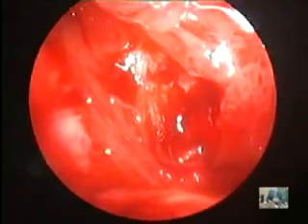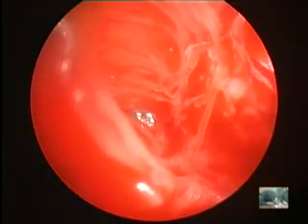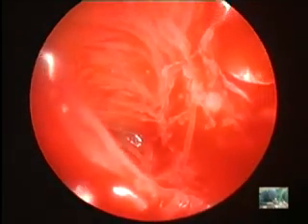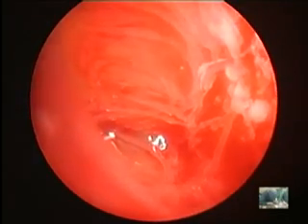This is the roof. Lateral wall. Inferior wall. Postero-inferior recess. Down there, it all looks very clear except for the edema. Yeah, this is the most posterior limit of the maxillary sinus. This is the floor.